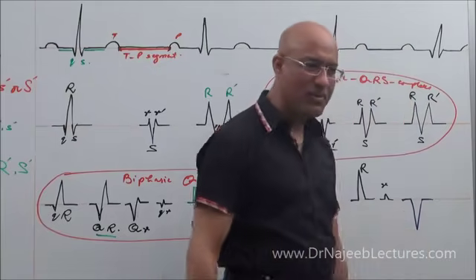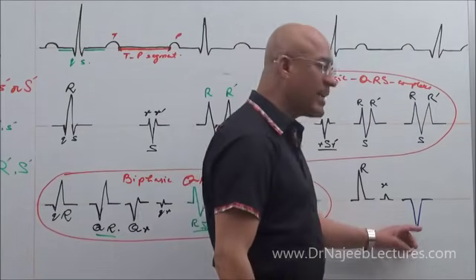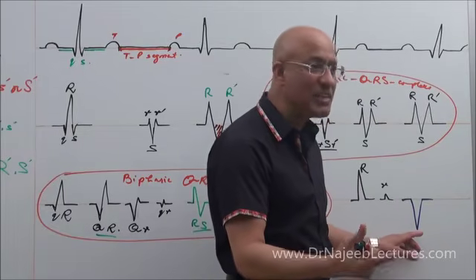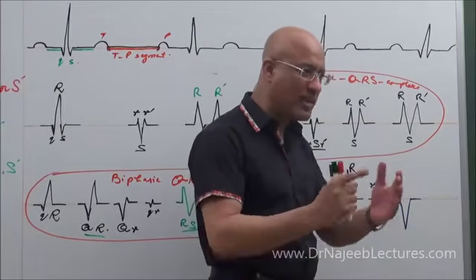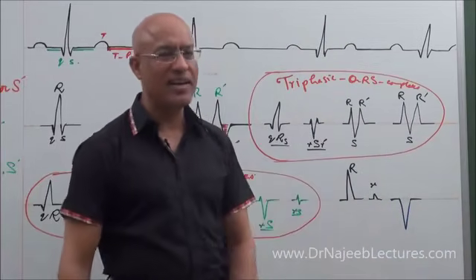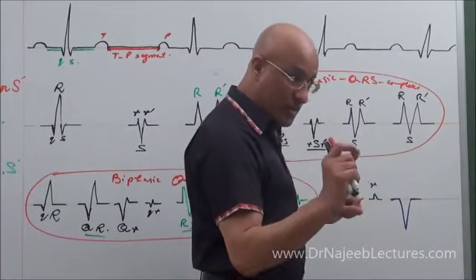Is there any R wave? But it is the first initial negative. It is initially negative, but not followed by a positive. Yes. The word initial is only used when it is followed by something. So, is it Q or S? The problem is, now concentrate.